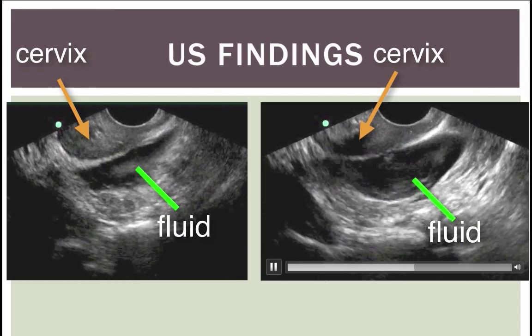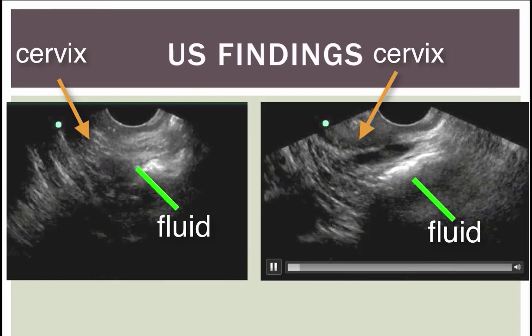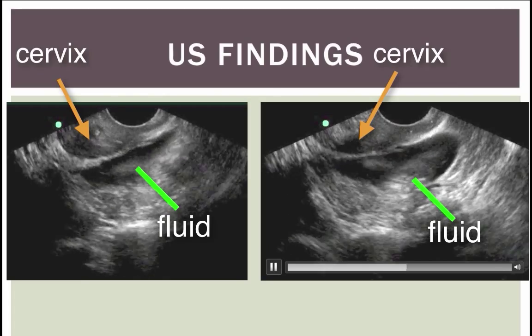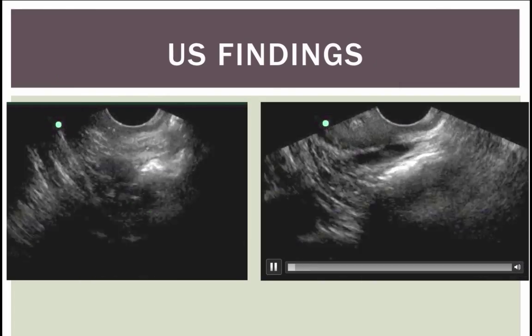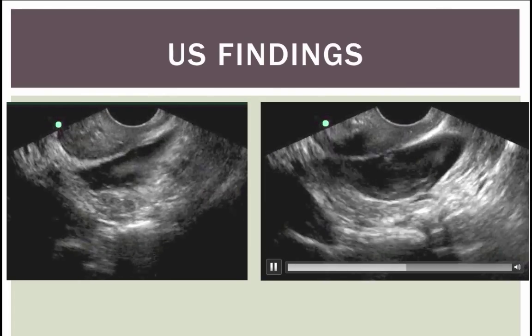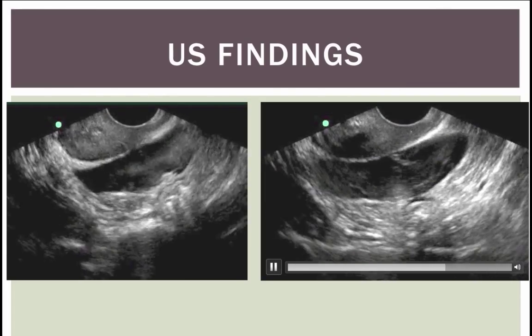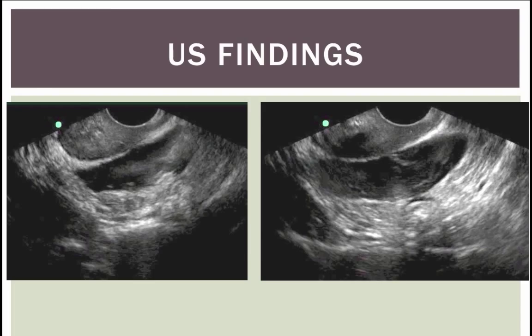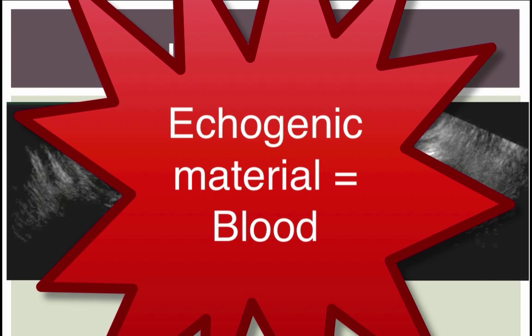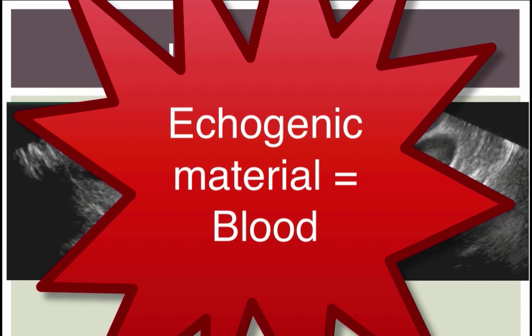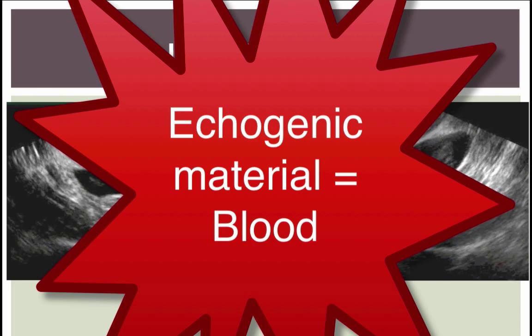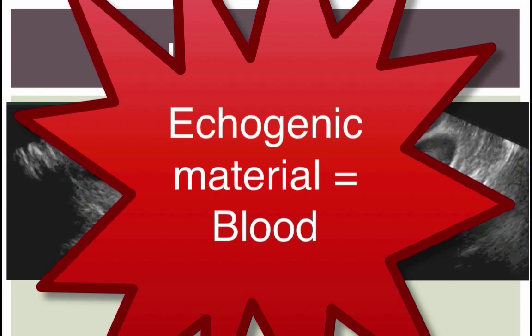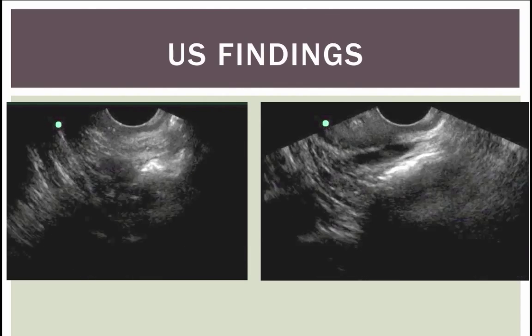We see it also over here - we see gray stuff within that free fluid. So this is not just free fluid, this is complex free fluid. This is blood that is clotted, or pus. But when we're thinking about ectopic, we have to be thinking this is probably blood.